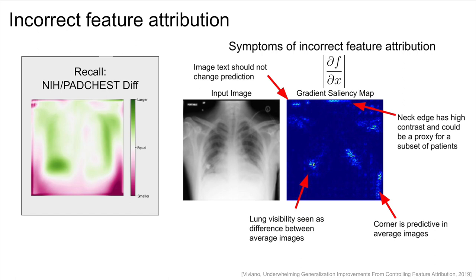Here, a model is trained to predict emphysema, but we intentionally correlated the hospital with the target label, so almost all patients with the disease come from one of the hospitals. We can see some telltale symptoms of overfitting here. Going clockwise from the upper left, we can see the text on the image can change the output of the model — this is not a good sign. We can see the neck cutoff is also predictive, which could be an artifact of the sensor location on the machine or the software used.